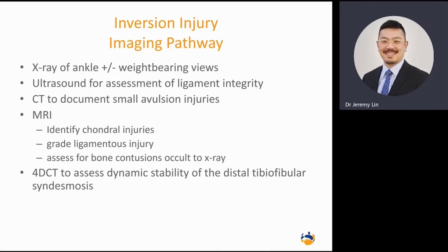Now, in the previous scenario, prior to the current Medicare discouragement of self-directed radiographs, what we often did, if we saw a potential fracture, and our radiographers are very good at picking up fractures, is they would tell us that this patient has had a fracture. What else do you want to do? And we would say, that's great, good pick up. Let's do weight bearing views comparing the two sides.